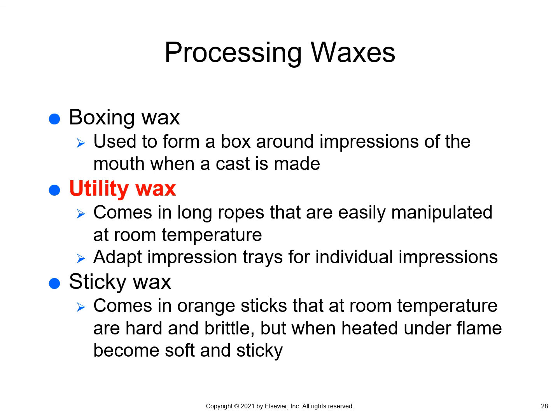Sticky wax comes in orange sticks that at room temperature are very hard and brittle, but when they're heated under flame, they become soft and sticky. Typically, a dentist will use the sticky wax. The dentist that I worked for would use this when he was making dentures.